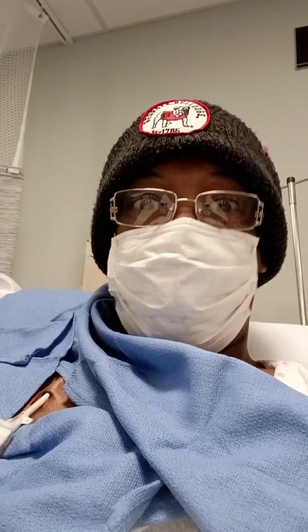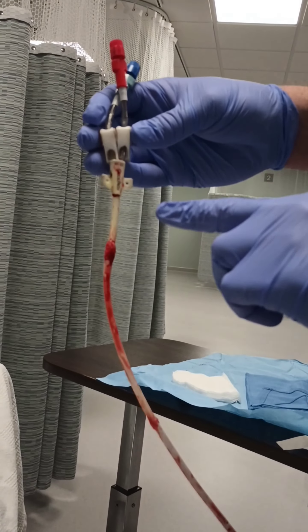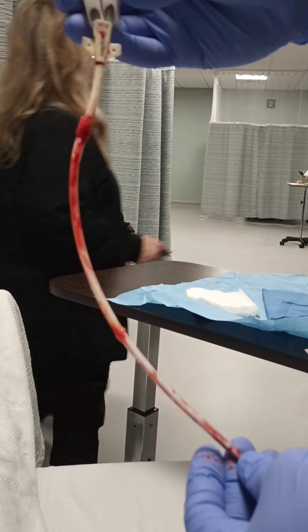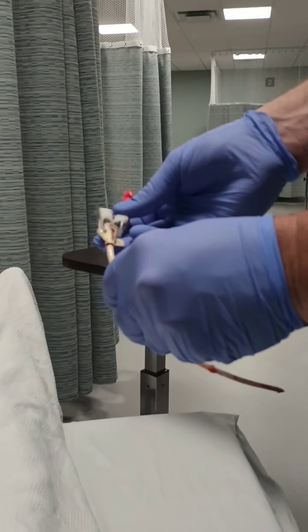Turn around for me. It's got two parts in it — all this was on the outside, that's the part you saw, that's where the two sutures went. That cuff went on the inside, it made scar tissue, and that part sits on top of your heart. So what you see is this on the outside, and what you put on the inside goes all the way to there.